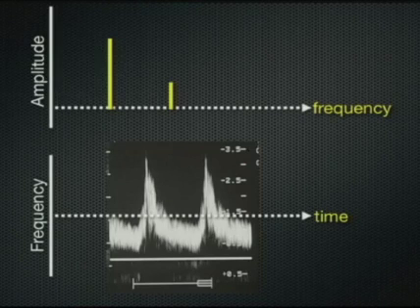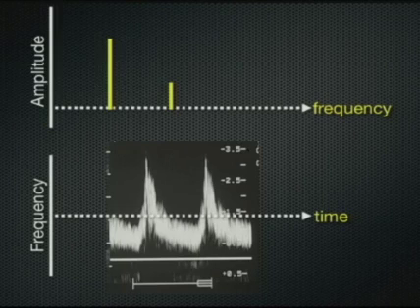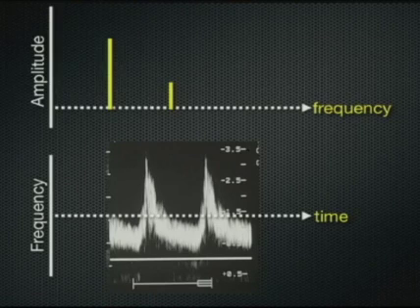At this point, we've talked a little bit about the source of the Doppler information that is processed and the way that we analyze it in the form of a Doppler spectrum. The next segment discusses the importance of the Doppler angle in our estimation of velocity using Doppler data.